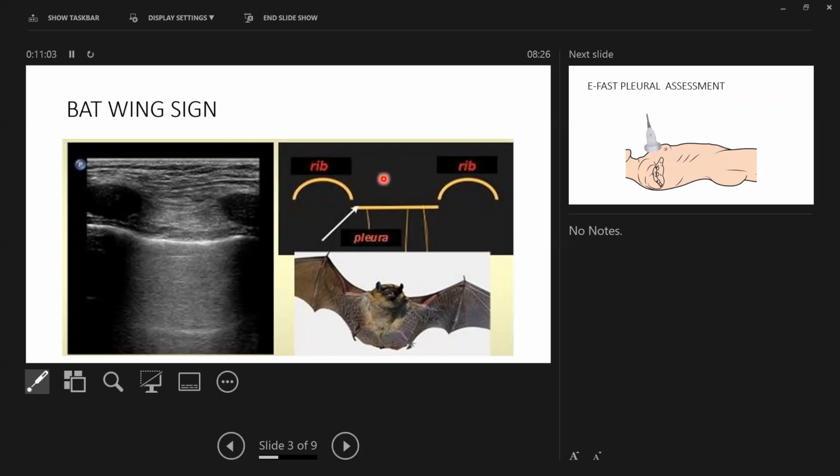So does everybody understand that? Anybody's got any questions about how that works so far? This is not in-depth lung ultrasound. This is basic lung ultrasound. I know it's still a bit technical because guys haven't really done this before. The other thing to note is how shallow the view is. So you're not looking for a big area. You're looking for a small area. You're looking for one piece of the pleura so that you can actually assess it. We'll get onto that now.